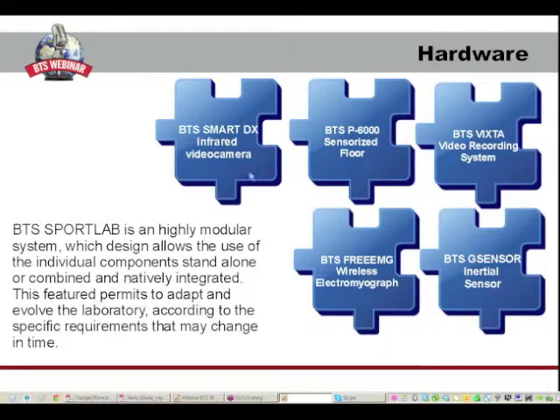Then, we can add BTS VIXTA, a video recording system in order to add further information to our analysis. Moreover, an electromyograph can give us information about muscle activities during all the tests, and this is BTS FREEEMG.